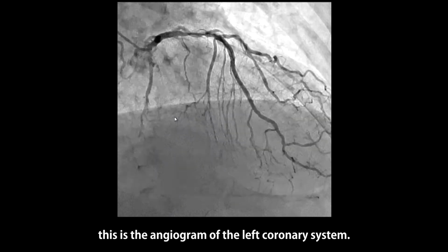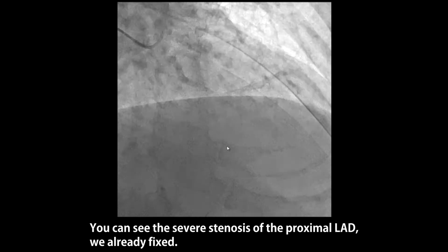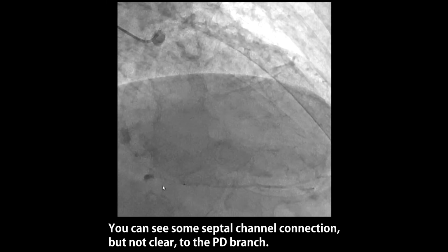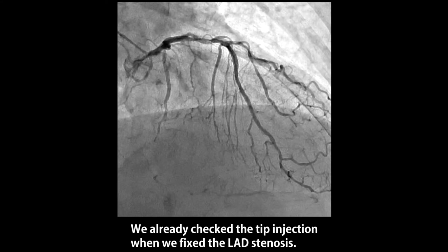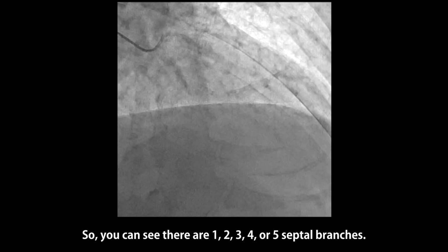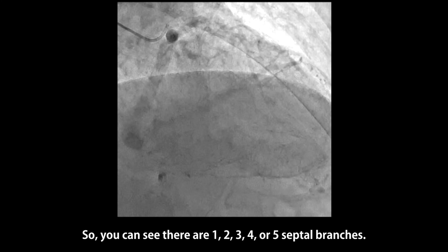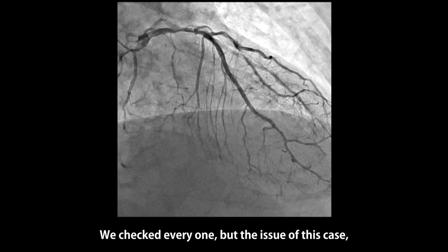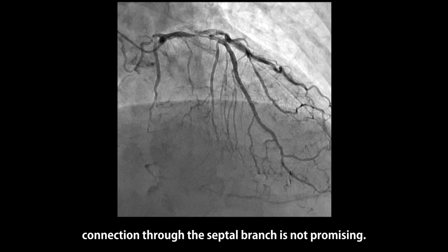this is the angiogram of the left coronary system. There you can see the severe proximal LAD stenosis, which we already fixed. And then you can see some septal channel connection to the PD branch, but not clear. We already checked with tip injection when we fixed the LAD stenosis. You can see one, two, three, four, or five septal branches. We checked every one, but the issue of this case is that the connection through the septal branch is not promising.